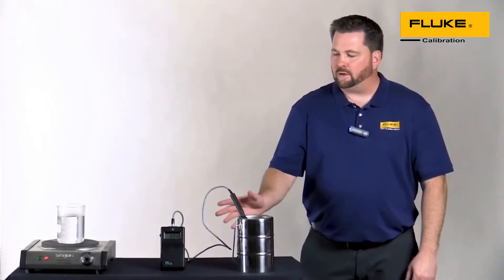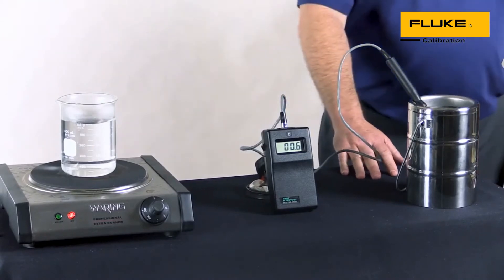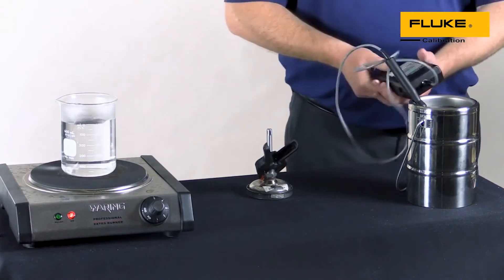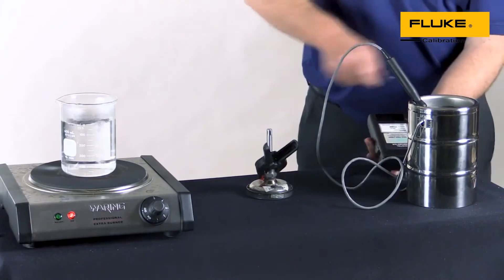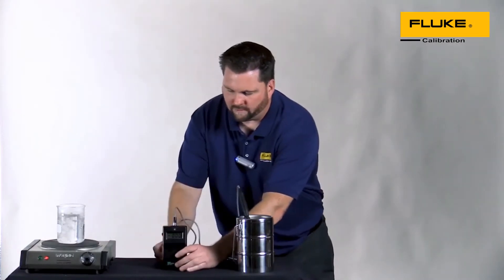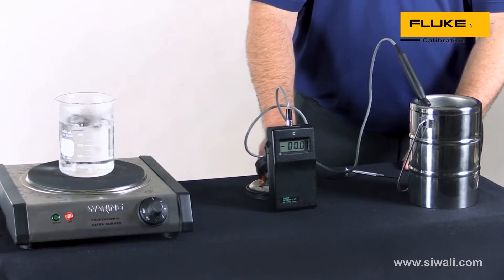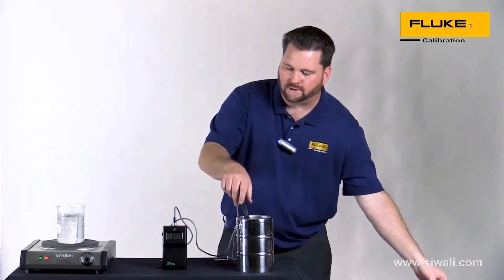I've got the unit under test sitting in an ice bath, and right now you can see we're measuring approximately 0.6 — a little bit off from where we want to be. I've made a quick adjustment and we're now dialed in right at zero. Now I'm going to move over and try this at the boiling point to see how we're doing on the linear side going up.